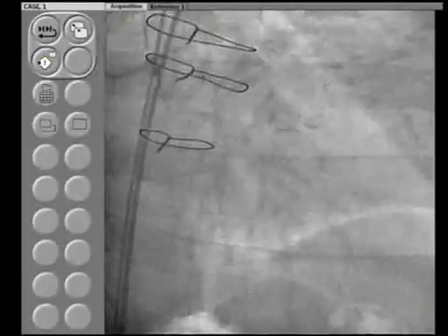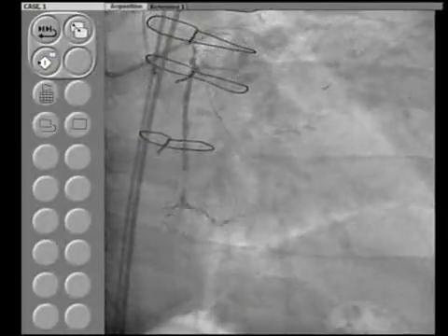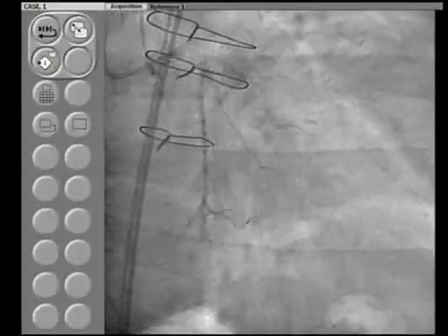Okay. Go antegrade right now. Good. No, 1 second. Don't give any more antegrade because there is a dampening now, significant dampening. Okay. Now go retrograde again.